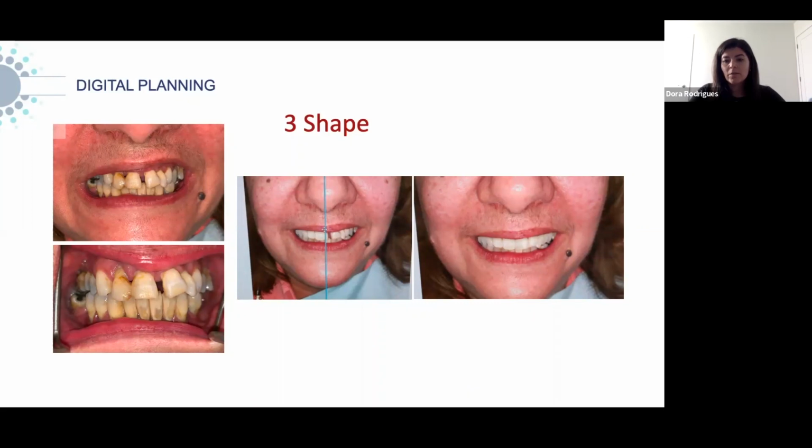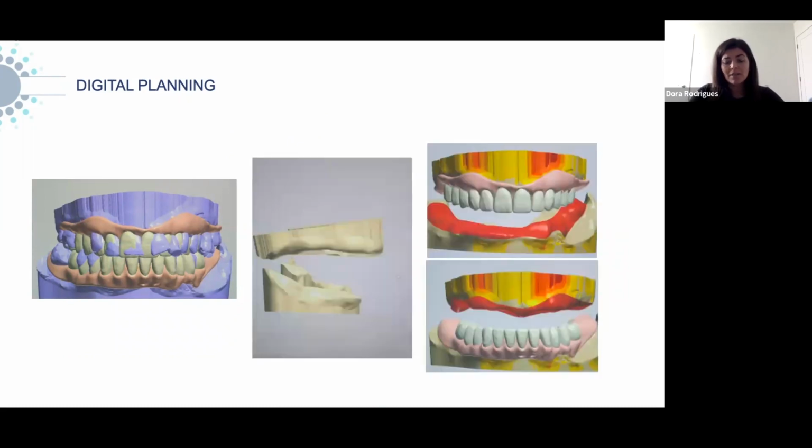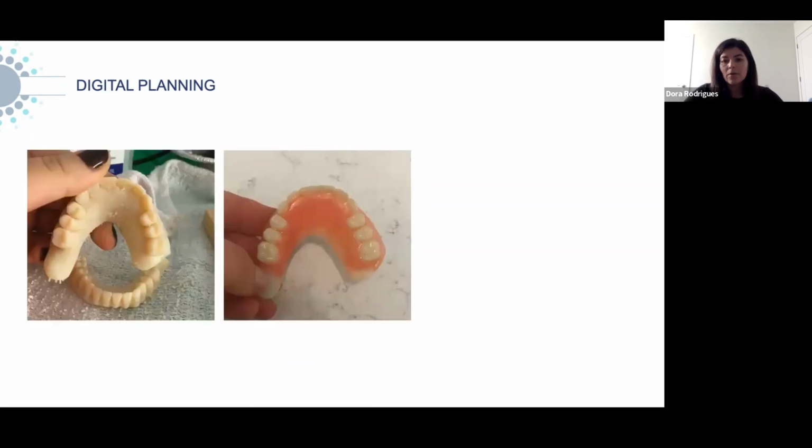He sends the photos to me. He also sends me the tooth proposal with the overlay with the old teeth, all the reduction that he did. And if you see, we have to be careful with the type of scans that we receive, because in those anterior teeth, there's barely any space for our flanges. So at this time, I was thinking, how are you going to do teeth and pink at that region? That's almost impossible. And the best decision at the time was to print everything in one color, just so it'd be a little stronger, and then add some pink around the tissue.